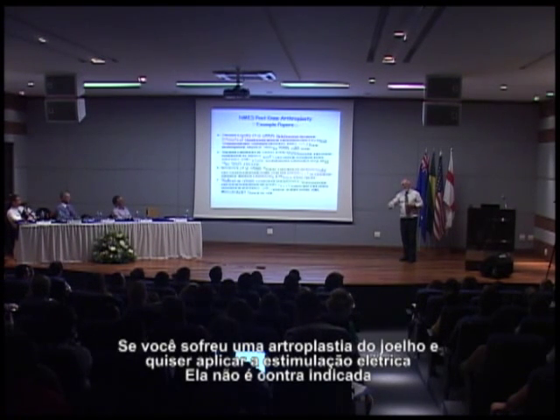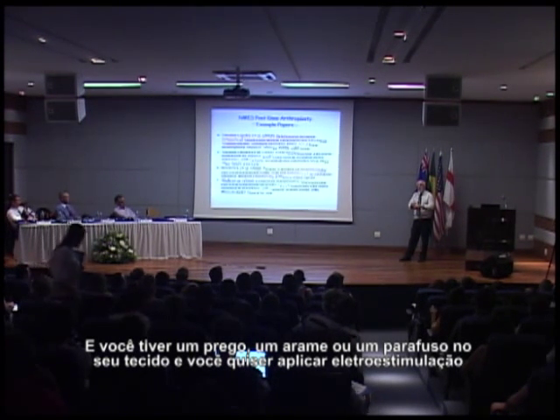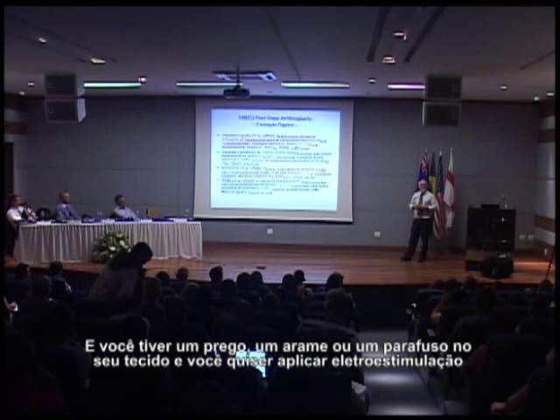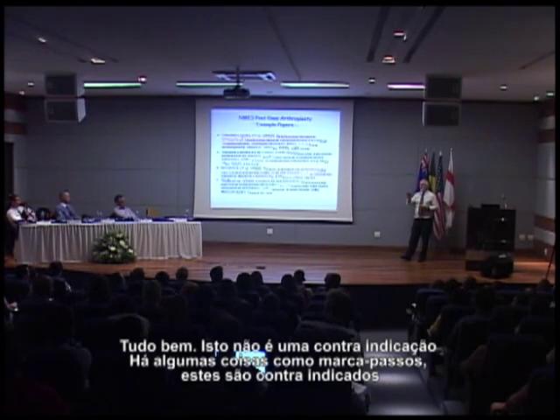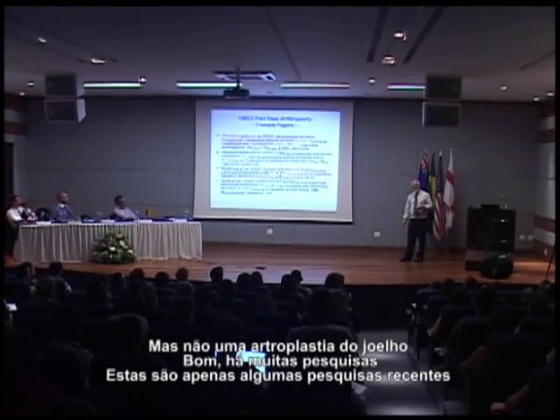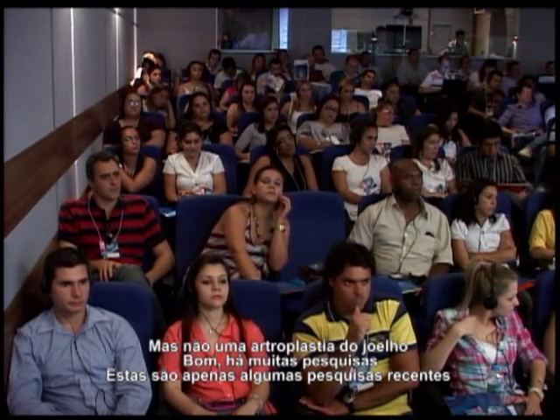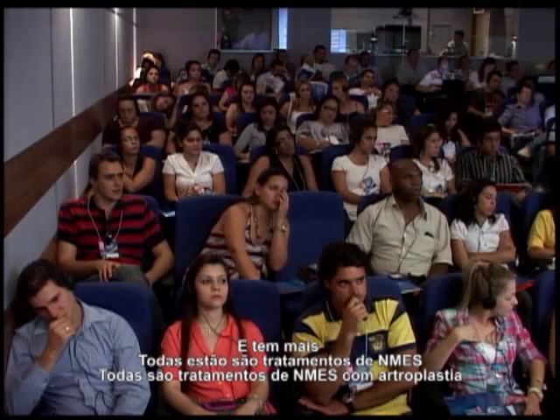If you have a knee replacement and you want to do electrical stimulation, it's not contraindicated. If you've got a nail or a wire or a screw in your tissues and you want to do electrical stimulation, it's fine. It's not a contraindication. All right? There are some things which are, like pacemakers. That's a contraindication, but a knee replacement is not. Anyway, there's lots of research. So this is just some of the recent research, and there's some more.